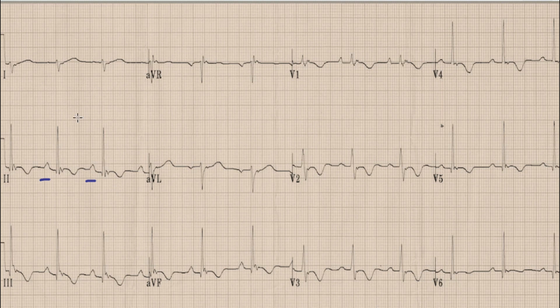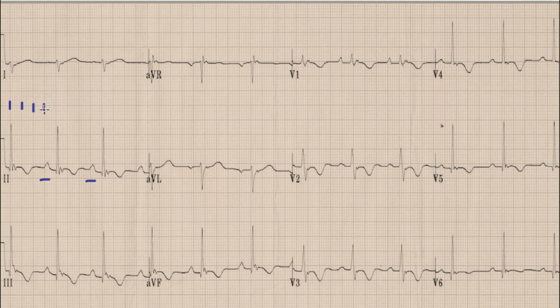The next step on an ECG interpretation is calculation of heart rate. For this we select a QRS complex which lies on a broad vertical line, and between this QRS complex and the next QRS complex the large boxes are counted as 300, 150, 100, and 75. So in this case the heart rate is about 75 beats per minute.